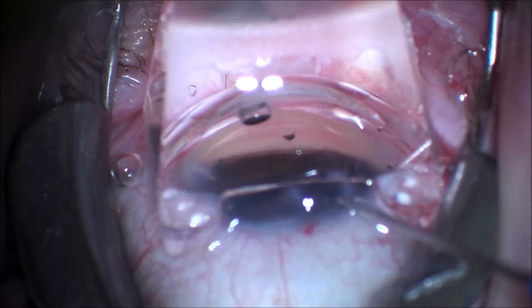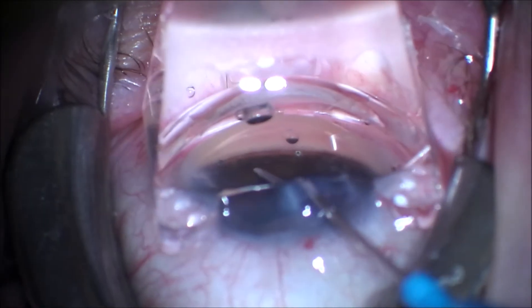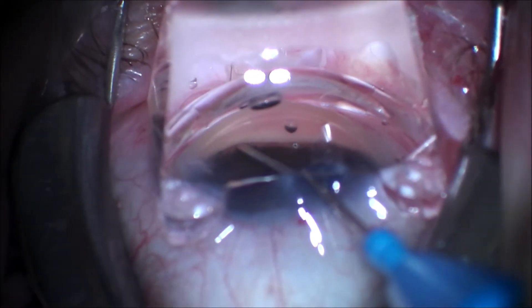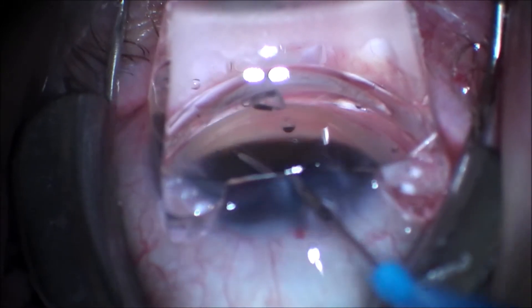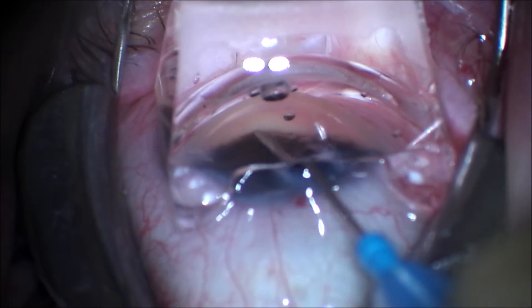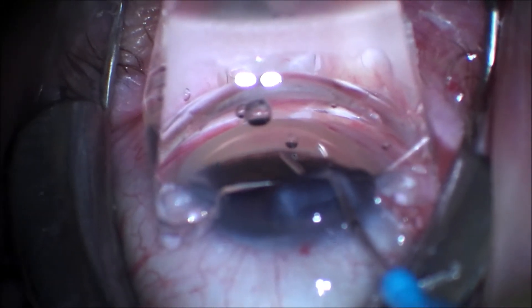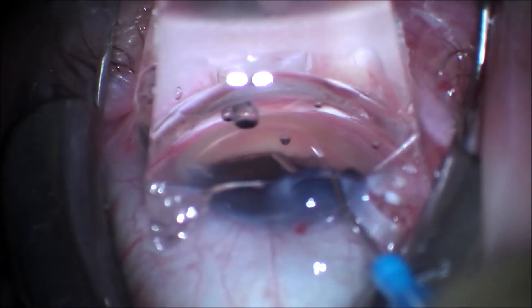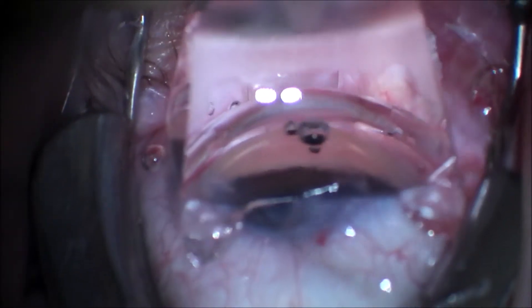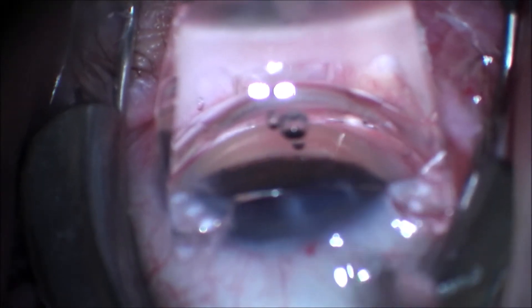with the trephination device to remove portions of the trabecular meshwork. Some pressure is required and a rotation movement will help remove the little sections of the trabecular meshwork. And you can see we've made three small goniotomies in between the two iStent injects.